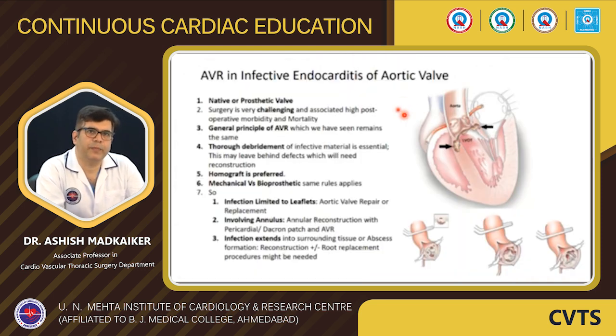Okay. The next important situation that we can encounter in our practice is of infective endocarditis, which can involve native or prosthetic valve. The surgery is very challenging and is associated with high postoperative morbidity and mortality. General principles of AVR, which we have seen, remains the same. Thorough debridement of the infective material is essential and may leave behind defects which will need proper reconstruction.